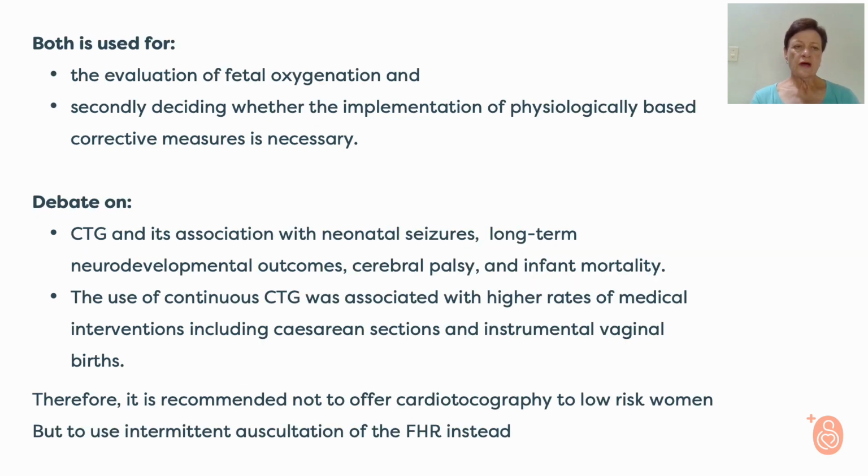Both auscultation as well as CTGs are being used for the evaluation of fetal oxygenation and to see whether the fetus is in a good condition during pregnancy as well as during labor. Secondly, depending on what we found in the evaluation of the fetal oxygenation, we need to decide whether we need to implement some corrective measures if there is a lack of oxygen, for example.